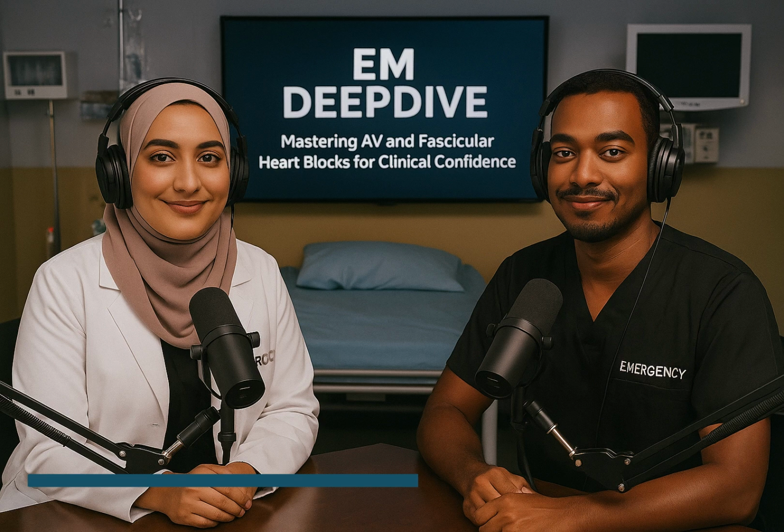What are the common patterns we'll actually see on the ECG for bifascicular block? How do we spot them? There are two main patterns you need to recognize. The most common by far is right bundle branch block, RBBB, combined with left anterior fascicular block, LAFB. First you'll see the signs of RBBB: a widened QRS, usually that RSR pattern, sometimes called rabbit ears, in leads V1, maybe V2 or V3, and often slurred S waves over in V5 and V6.